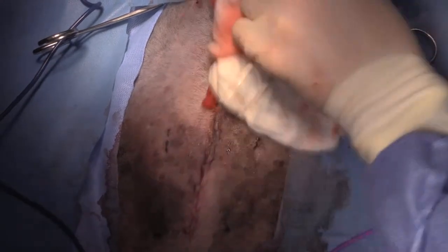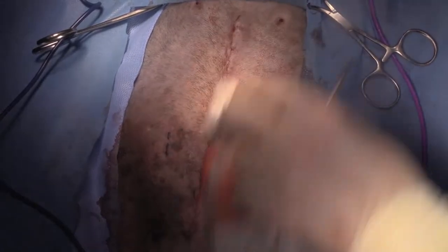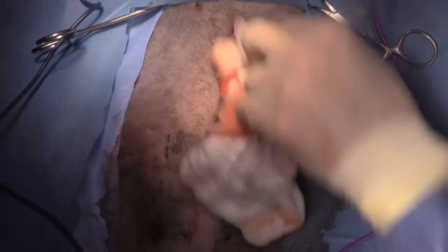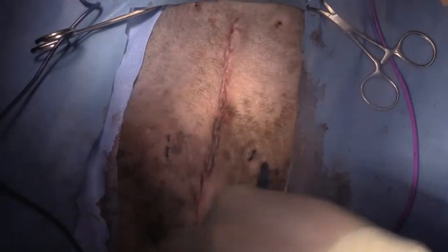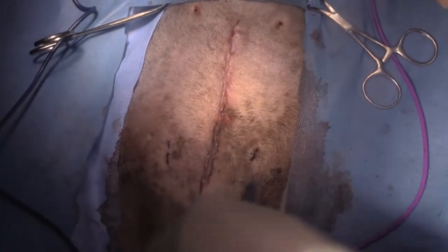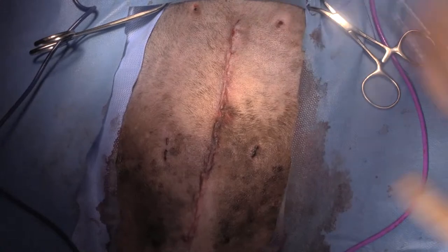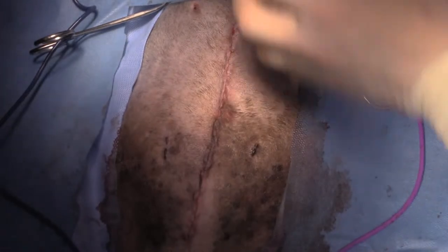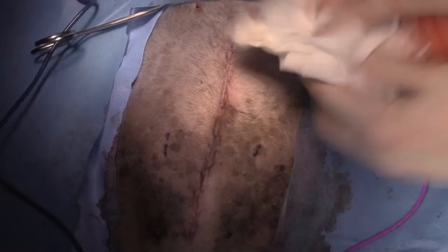And then once it goes home, it'll probably go home with a fentanyl patch or some codeine. We haven't decided yet what opiate medication we'll go home with, plus or minus a non-steroidal anti-inflammatory in order to keep a lot of the surgical swelling down. So that's all finished now. So we'll get a dressing onto this area. All of our patients' wounds get covered with an Opsite adherent dressing with some melolin underneath it to keep the wound healthy for the first few days at least, but we routinely will keep it on for about 7 days.